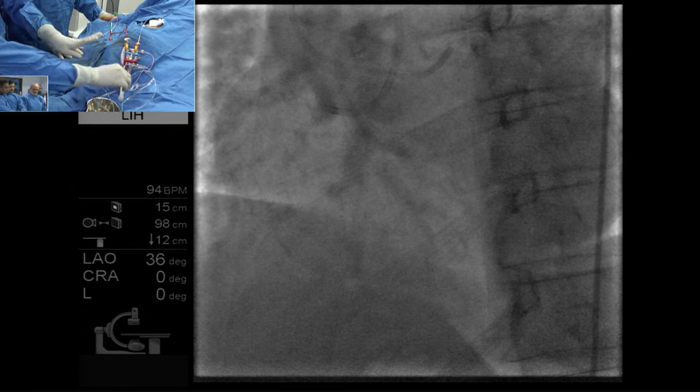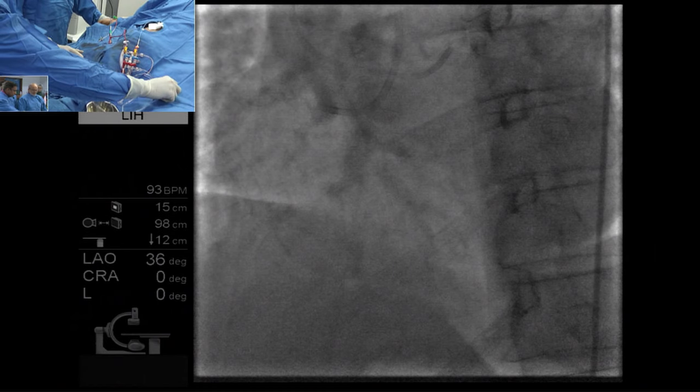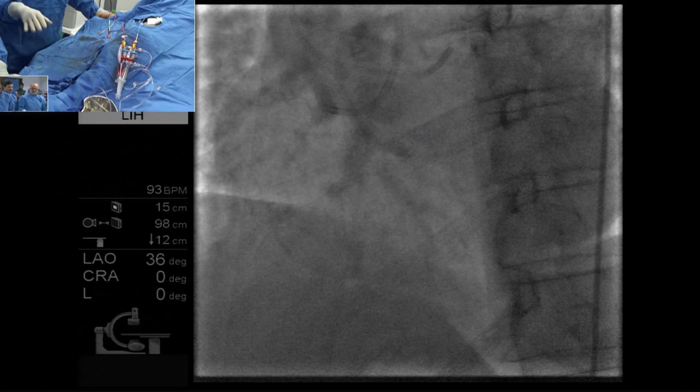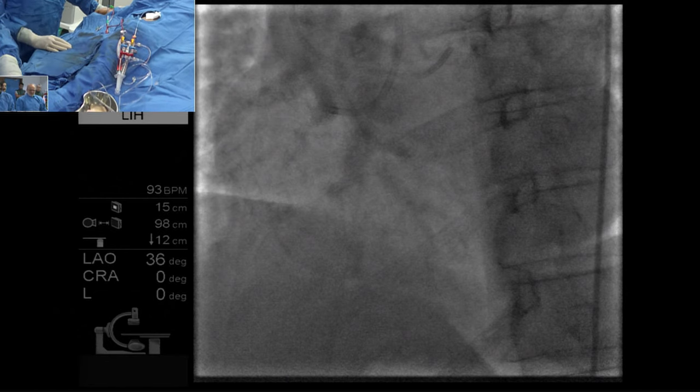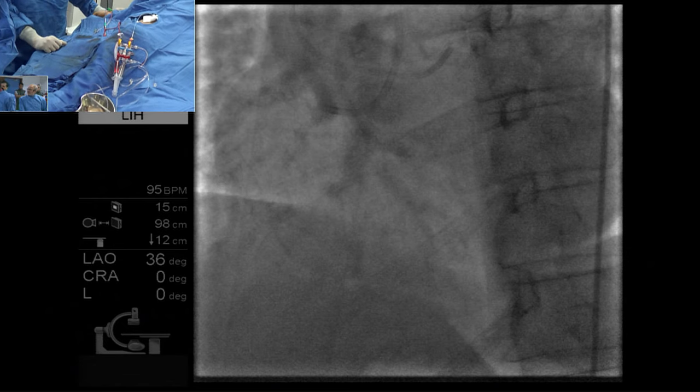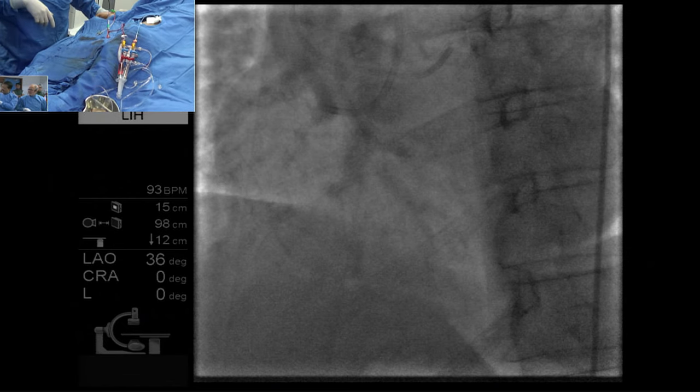Okay. Pilot 150, but take it along with the microcatheter. It will be easier for that exchange. First dilate, then we will introduce the micro, then Fine Cross the distal part. Yes, go hard on this. That is the idea.